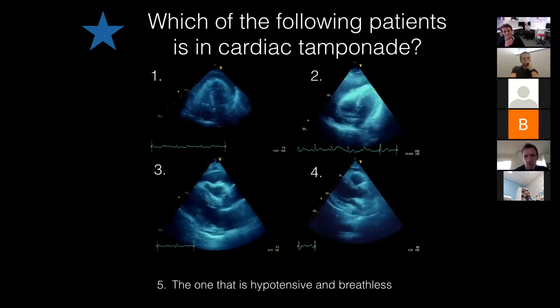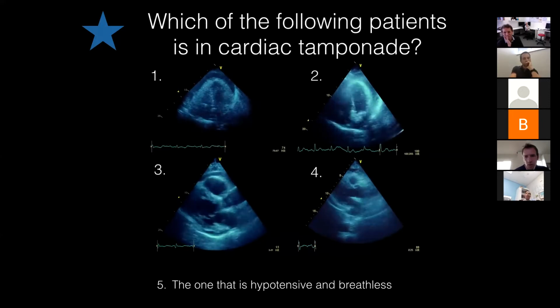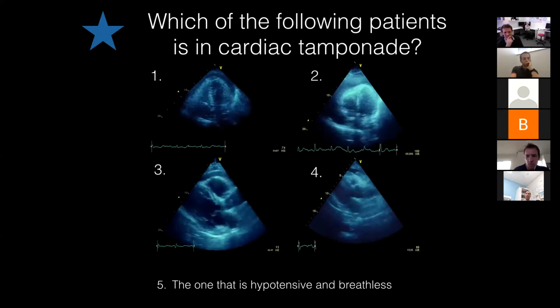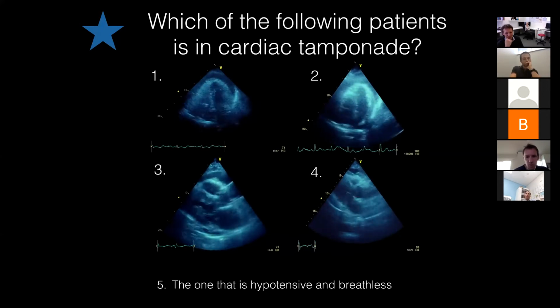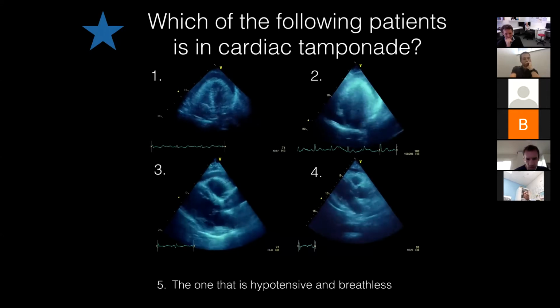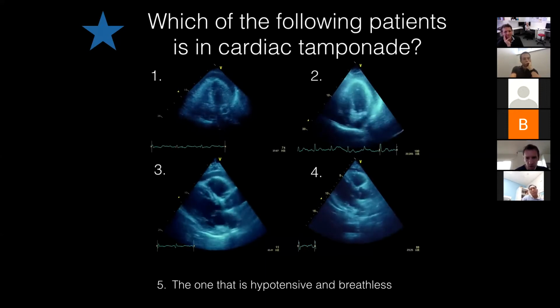Obviously, the heart also seems to be bouncing around a little bit in the sac, which can make it more difficult, and you would need to see a little bit more. So then about 3, I'm not sure whether you get systole and diastole here, but I would be worried about that. You could put an M mode through it and then correlate it nicely with your ECG.